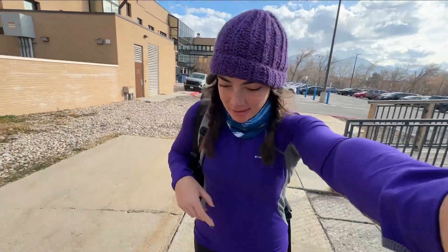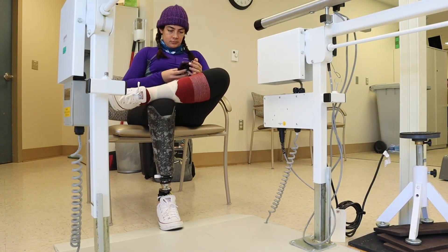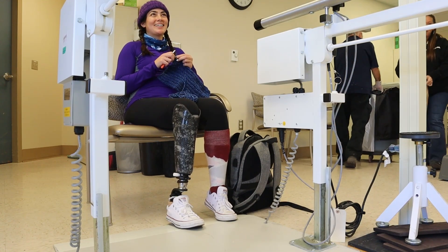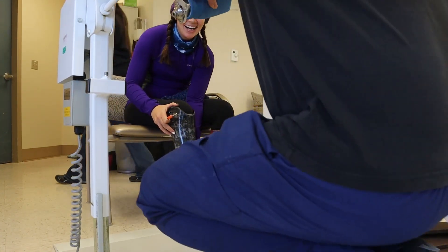All right, take two of trying to get my check socket. It is Thursday. My new leg should be fabricated — fab-ricated. Hopefully it goes good this time and I get to bring home a leg. Are you ready for me to break another leg? I'm ready for what? For me to break another leg? No, you're not breaking it. Just to see how it's not clear.